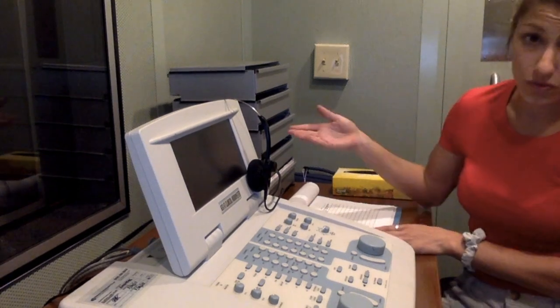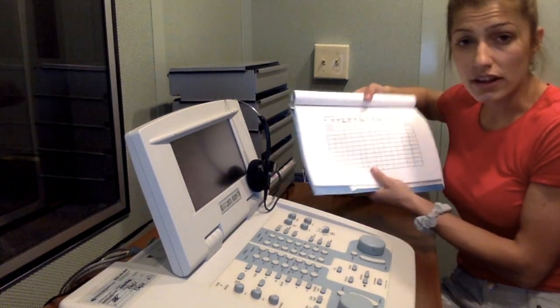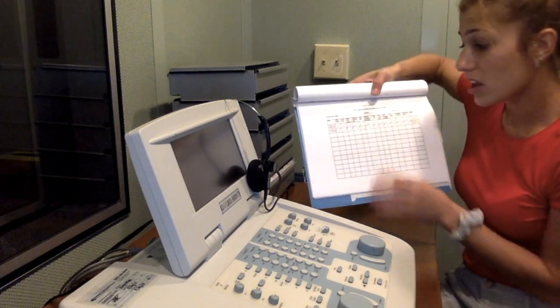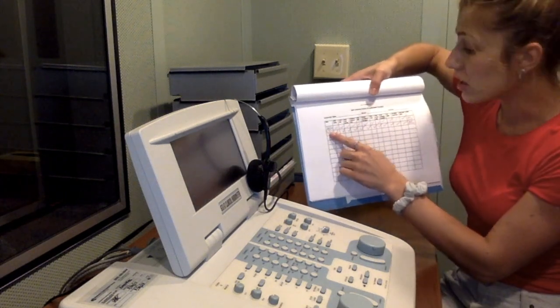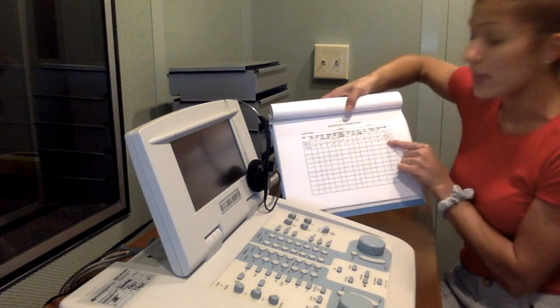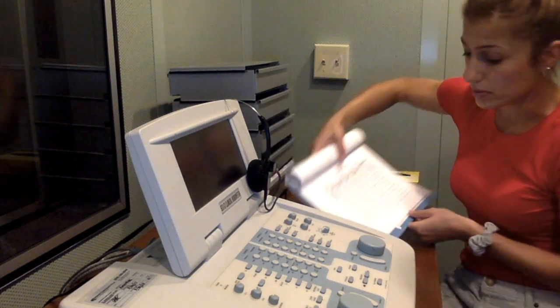If you walk into the room right next to the file cabinets, this is your soundproof booth where you can complete your hearing screening. In here is where you'll find the diagnostic audiometer, which can be used for your hearing screening. You'll also find the biological check checklist, which should be completed prior to your screening. You would put the date, the check marks showing that you did each step and that the biological check was a pass, and then put your initials to show that you completed it.